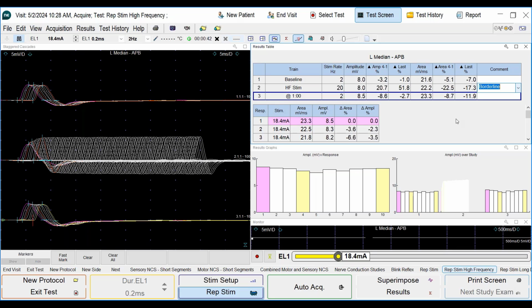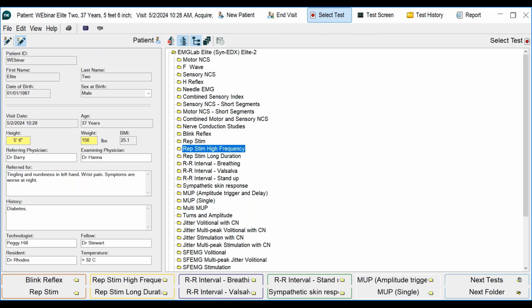It is definitely uncomfortable if you are going to do high frequency stimulation. By automating, you can make things happen at the correct time with the correct frequency and so forth. Focus more on the patient. The same applies to the uncommon protocols that we use for the short exercise and long exercise.